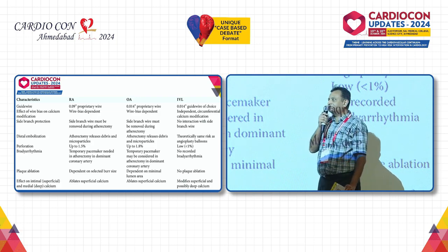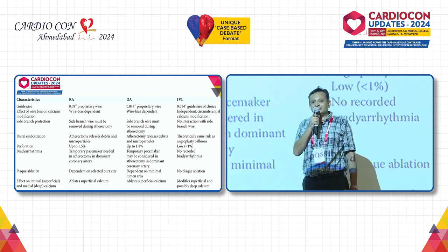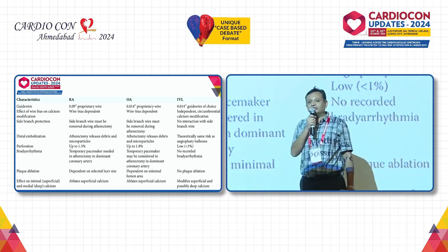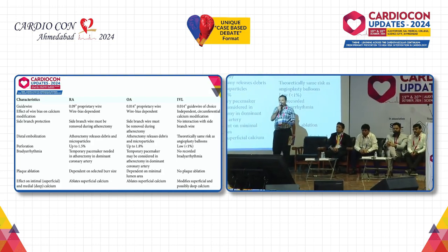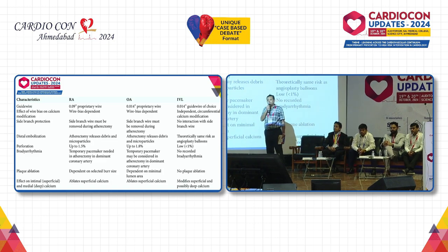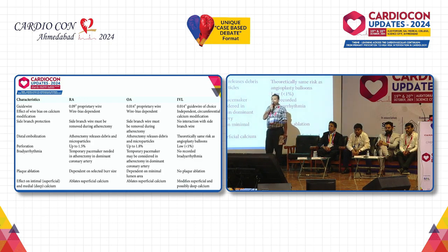Second, intravascular imaging is very important in this group of patients to decide eccentric calcium, concentric calcium, or calcium nodule. If you find a calcium nodule, then it is very difficult for intervention because of the high risk of perforation and dissection, so we can decide by IVUS or OCT. Both have advantages and disadvantages. OCT can assess the thickness of the calcium, but IVUS cannot. However, IVUS is more useful for circumferential assessment of the arc of the calcium.